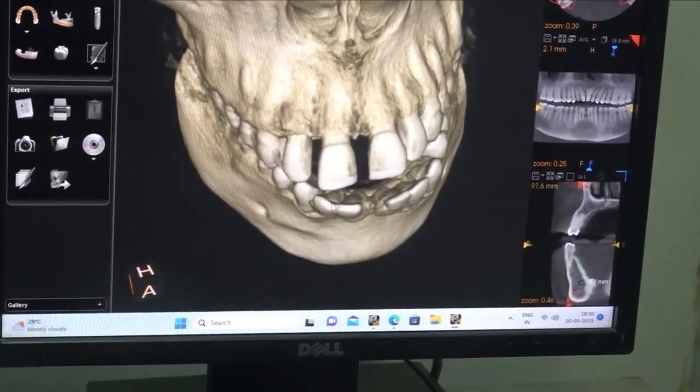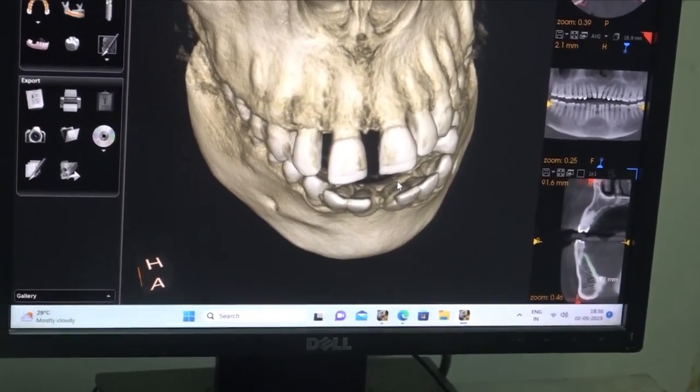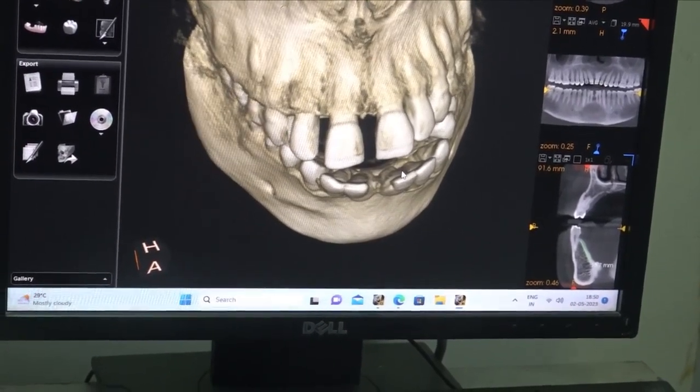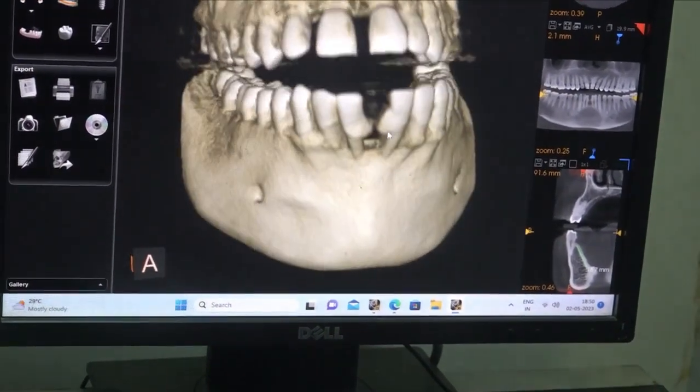And another reason is the arch is expanded out. So we are going to give the teeth inside. When you are giving teeth inside, the arch length decreases. That means a smaller number of implants is needed. That is one other explanation.